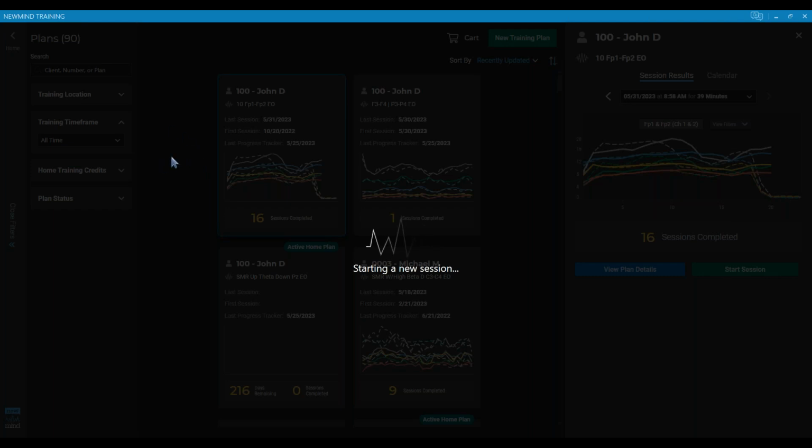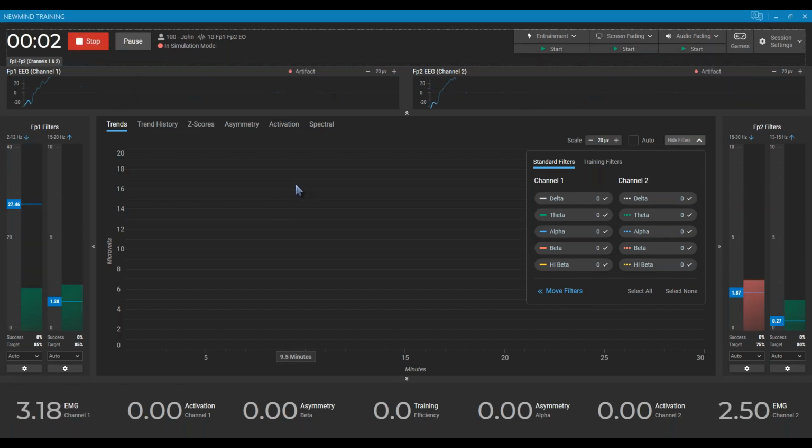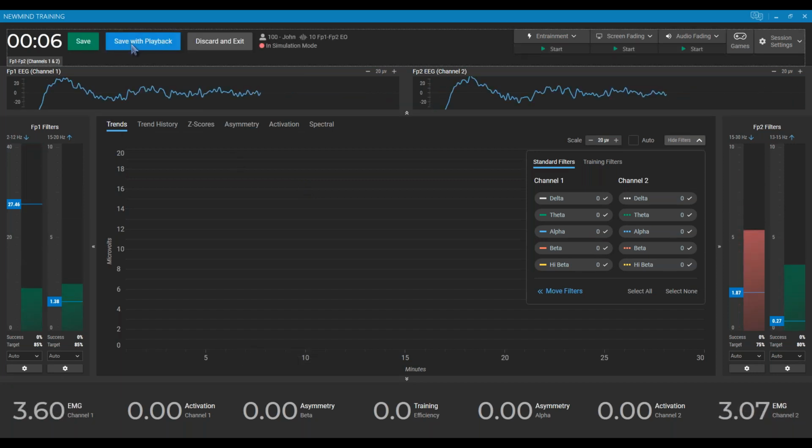And that goes too for heat pads or anything like that. You just don't want to have anything powered. Any other questions on artifact interference?